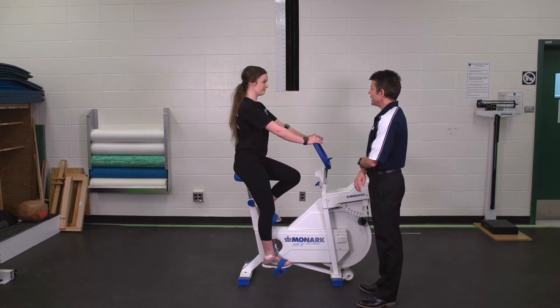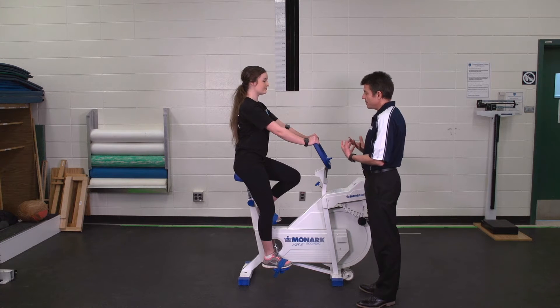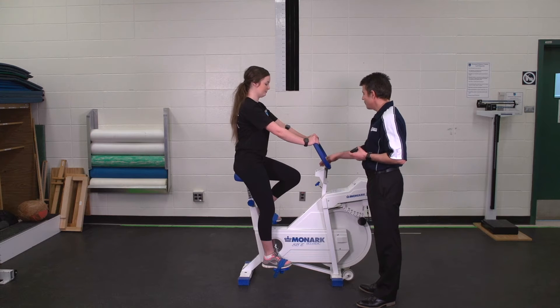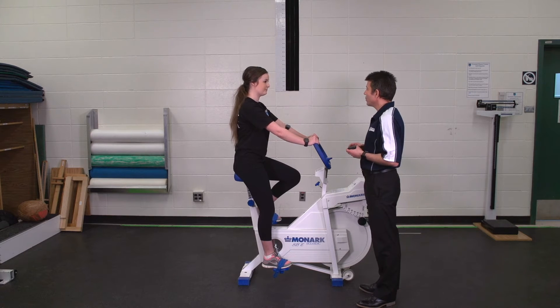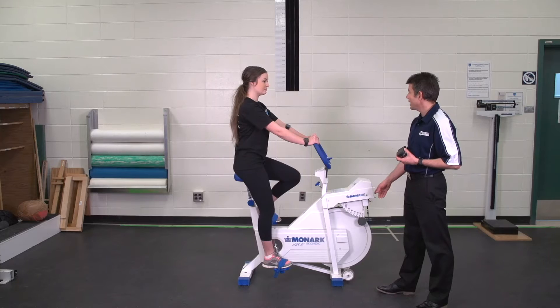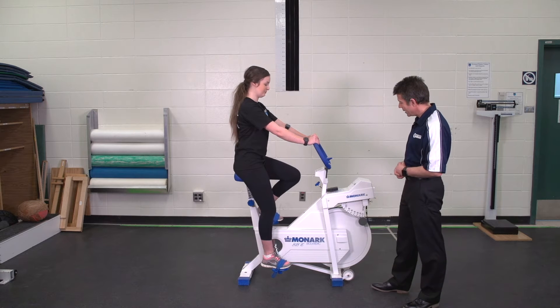Okay Alara, we're going to start the test now. What's important for you to do during the test is to keep the pedaling cadence at 50 RPM. I've got a metronome here — I'm going to set it to 50, and every time it ticks you'll be doing one revolution. There's also a visual indicator on the bicycle itself if you want to follow that. I'm going to set your initial workload at 0.5 KP, or 0.5 kilopond. Go ahead and start pedaling.